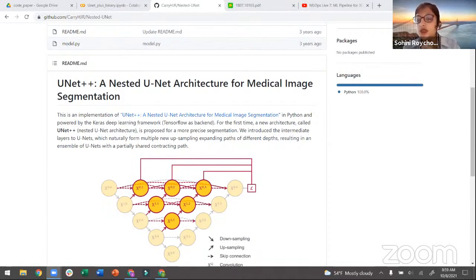So we are continuing our MLOps journey from last week. Last week we started a use case, which is medical image processing, and I know most of my viewers here are in that domain. We talked about how to create a data pipeline for a 3D medical image stack. So whenever you have not just one image, but a few image stacks, how would you go about ensuring that you have a data pipeline? And today we will be talking about how to create an ML model around it.